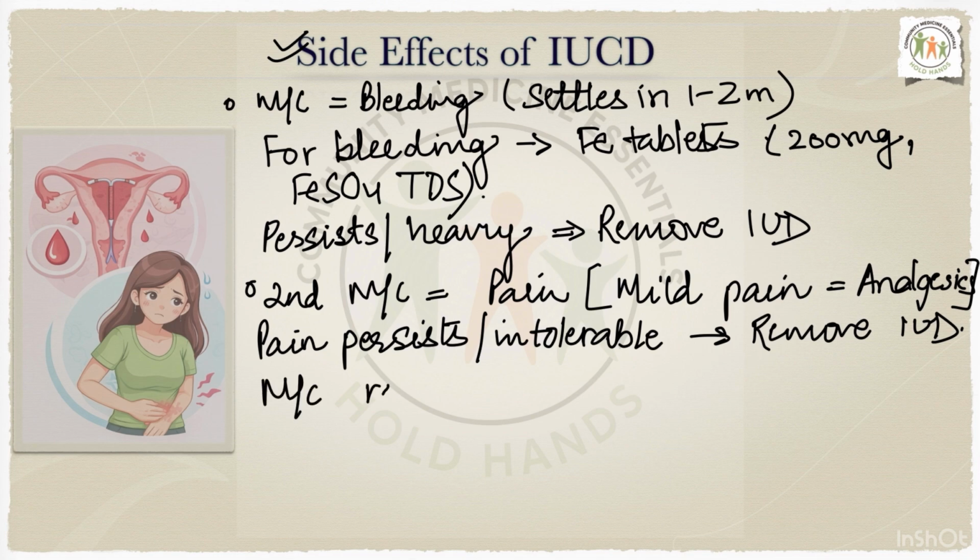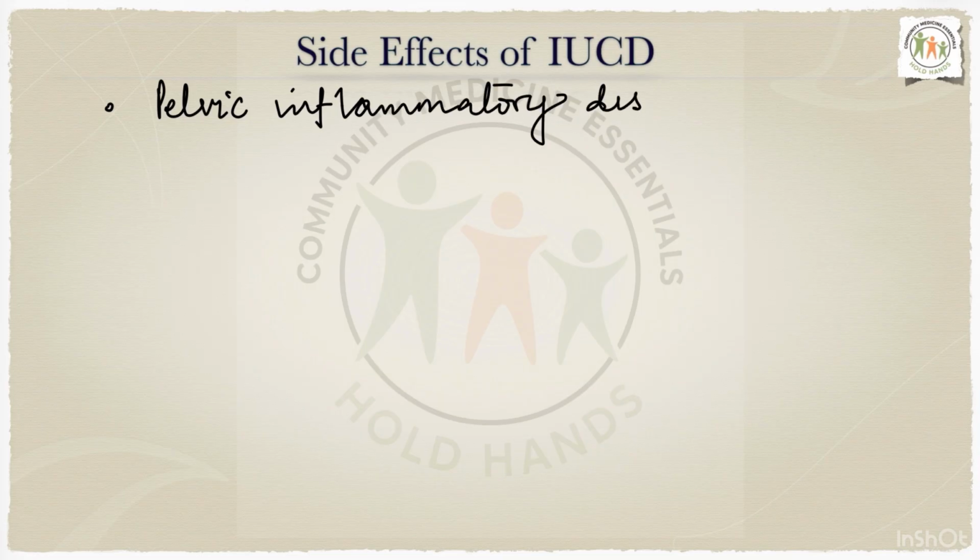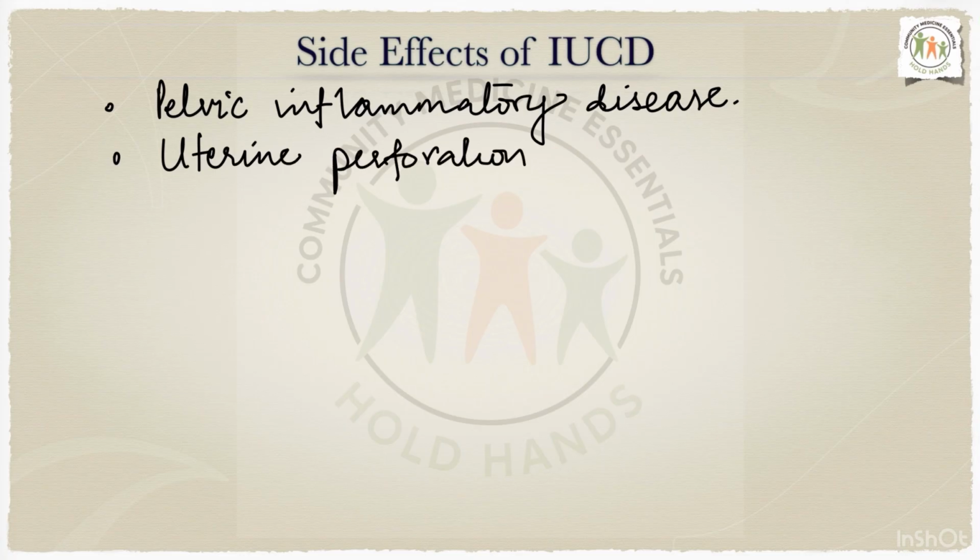Pain is the most common reason for removal of IUD. Other important side effects are pelvic inflammatory disease, uterine perforation, and ectopic pregnancy.